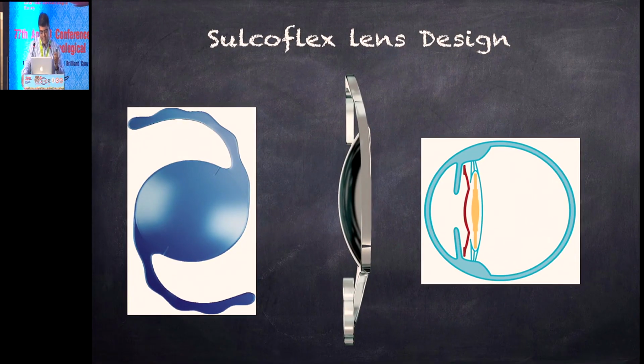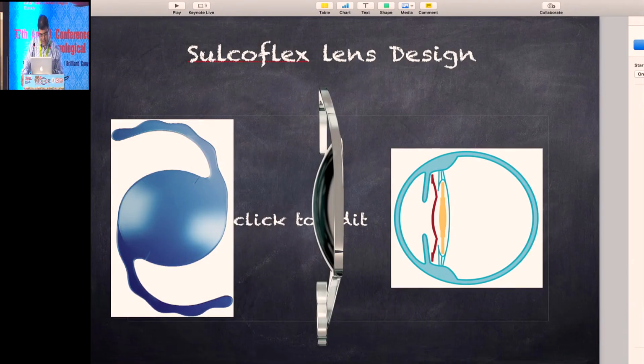So this is a Sulcoflex lens design. I think if we have a situation like this, everything is not lost, and we can rectify this situation.